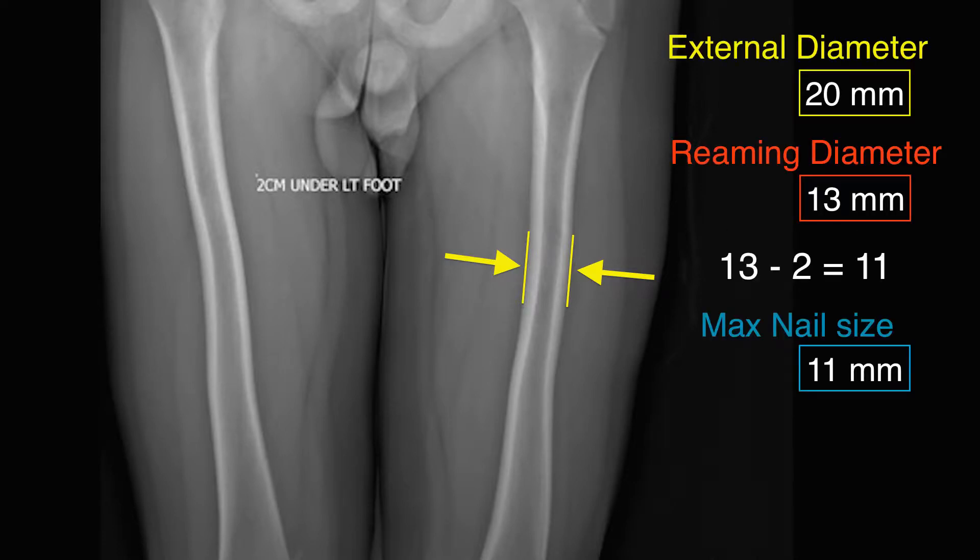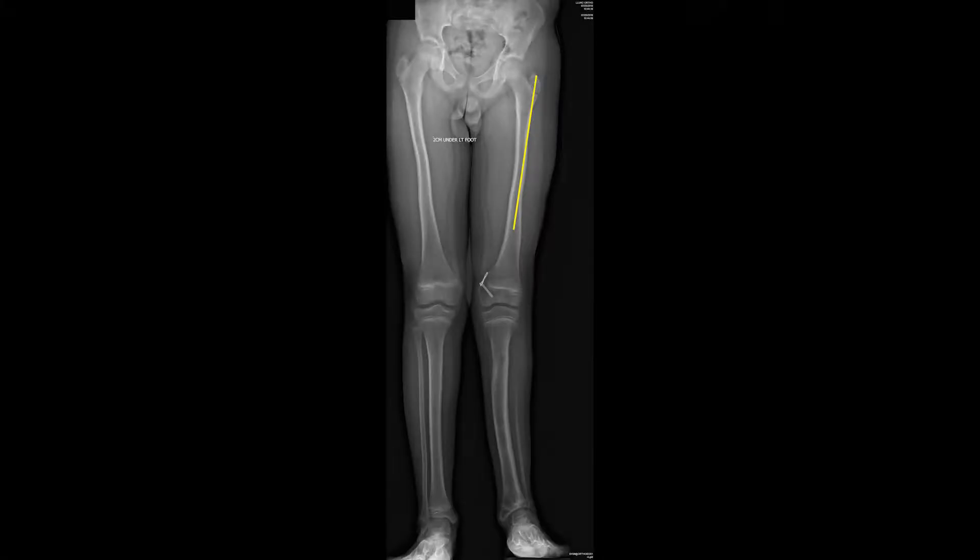It is necessary to ream at least 2 mm larger than the nail. This is because the nail is straight, and we want it to slide in easily in order to avoid damage to the gear shaft and allow lengthening to occur without restraint. So for this case, we ordered a 10.7 mm nail diameter. The desired length of the nail is then assessed by measuring from the tip of the greater trochanter down into the distal diaphysis.